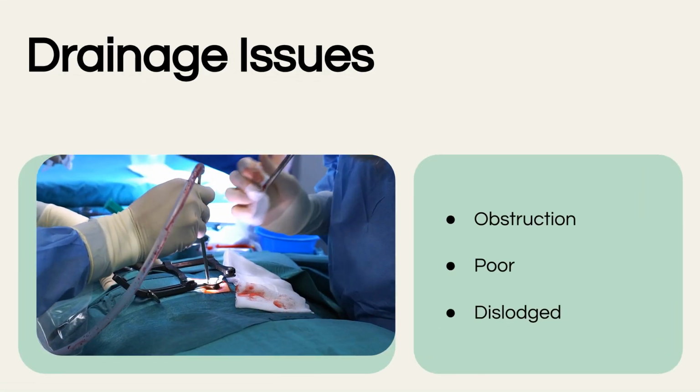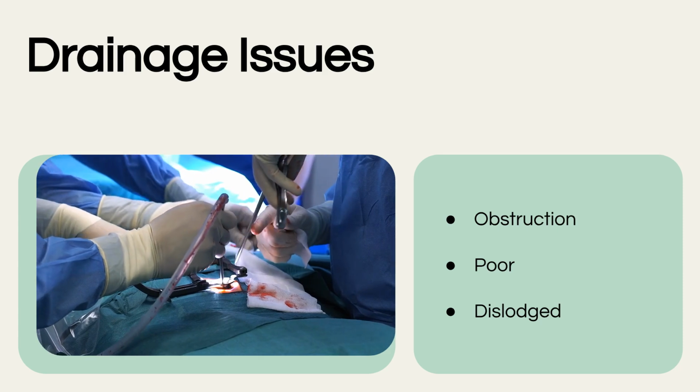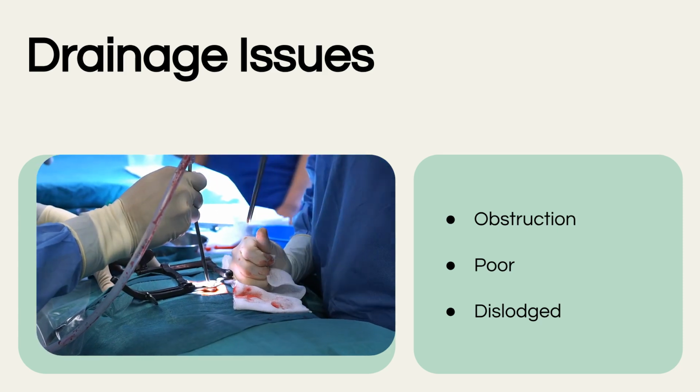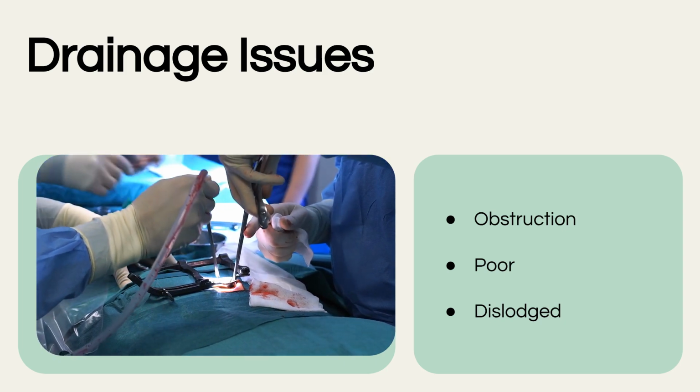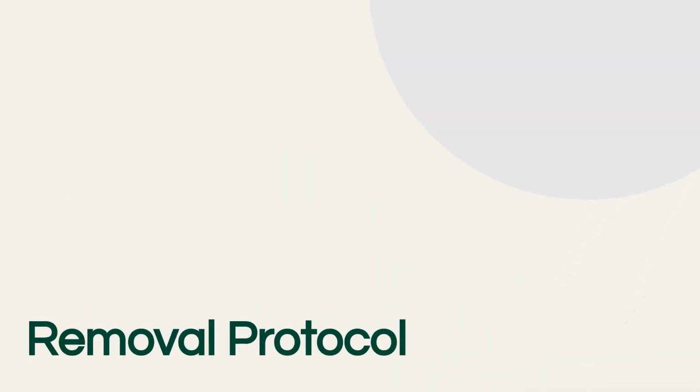Inefficient drainage often results from obstruction, poor placement, or selecting a drain too small for the fluid viscosity. If a drain is accidentally removed, apply a sterile dressing immediately. Knowing the correct protocol for drain removal ensures patient comfort and proper wound closure.